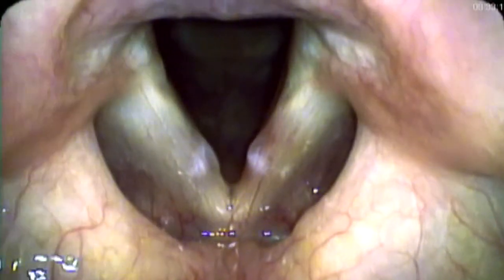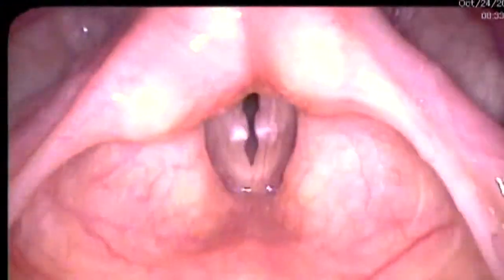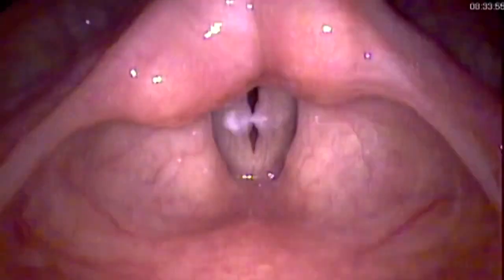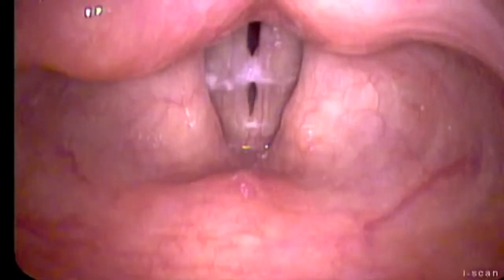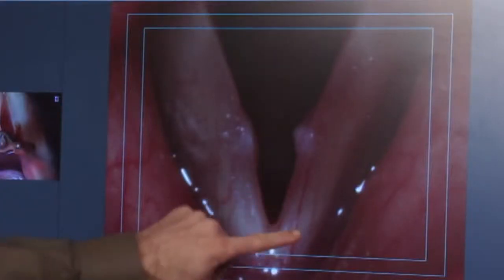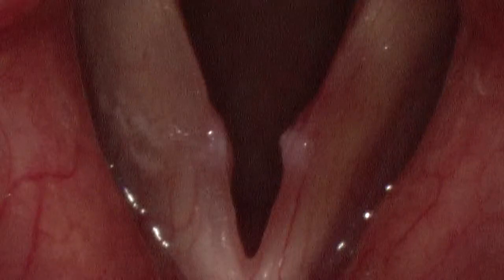So now we'll listen to her at low pitch, and when we do, we will hear the roughness because these bumps are not the same mass, so both vocal cords vibrate differently. And we hear that as two pitches, diplophonia. As I make her go up in pitch, now we can watch, and we hear the short segment phonation from the vibrations of half the vocal cord. Here's a close-up view with a rigid high-definition scope. Here are the blood vessels again heading into the polyp.